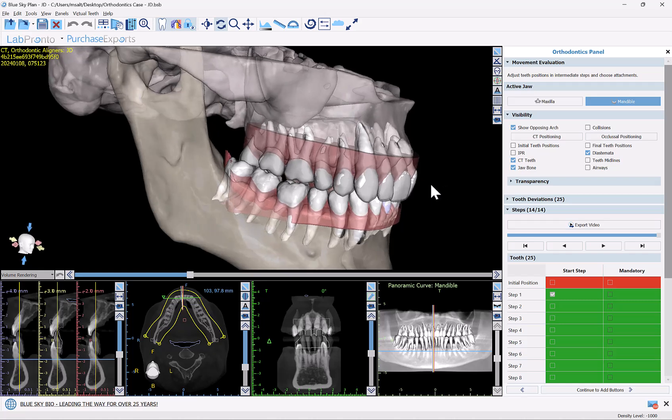This plan contains the actual segmented CT teeth with the root data. Blue Sky Plan automatically segments the teeth and the bones, and automatically aligns the data from the CT scan to the data from the optical scan, so you can plan with complete anatomical information and true anatomical movements, directly affecting the efficiency of the aligners and reducing mid-course refinement cases. While the CT scan is not a requirement for aligner planning in Blue Sky Plan, it is highly recommended to scan the patient optically and with the CT scan, load both into the software, and plan based on the full anatomical data.